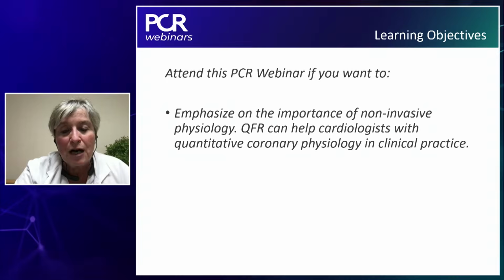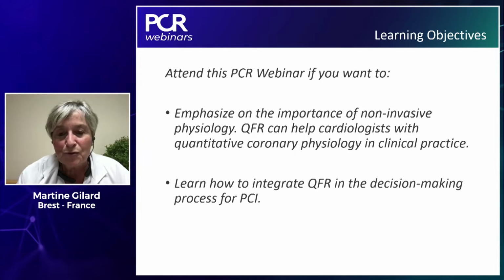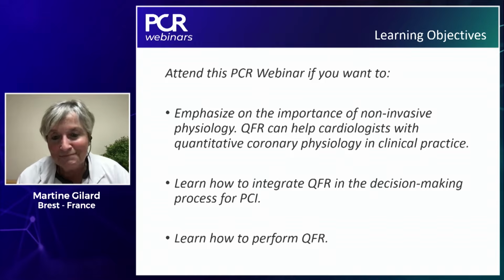As you know, besides the invasive FFR, the QFR adds a functional component to coronary angiography by using a computer simulated hyperemia. The objective of this session is first to emphasize the importance of non-invasive physiology. The second is to learn how to integrate QFR in the decision making for the PCI procedure. And the third is to learn how to perform QFR.